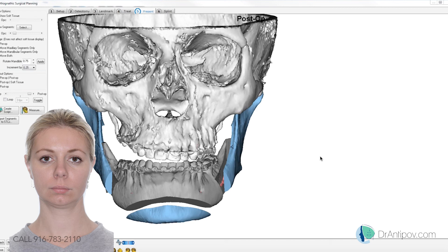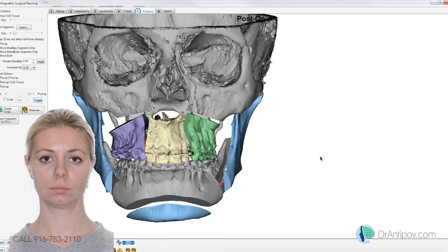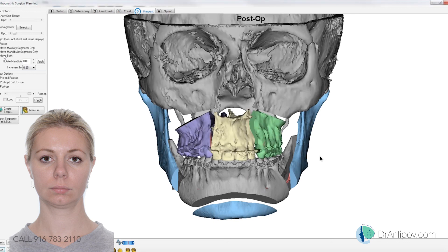Are you going to be doing maxillary surgery first or mandibular first? Mandibular first. Okay, so your first contact is going to be at these left canines right here — yes. That'll be your intermediate position from the profile and from the front. She's pretty asymmetric — you don't realize when you look at her face because she has a lot of soft tissue that hides it.